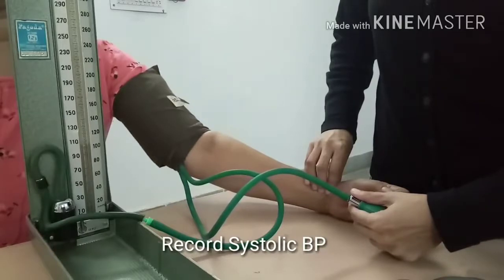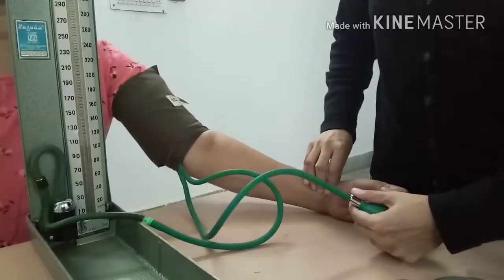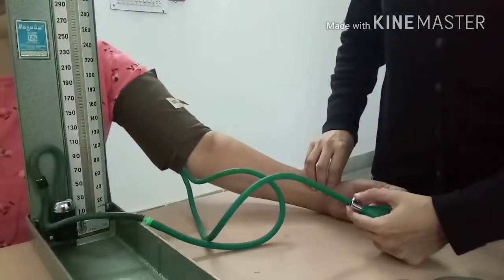This is systolic blood pressure. So by palpatory method we can get a rough idea of systolic blood pressure.